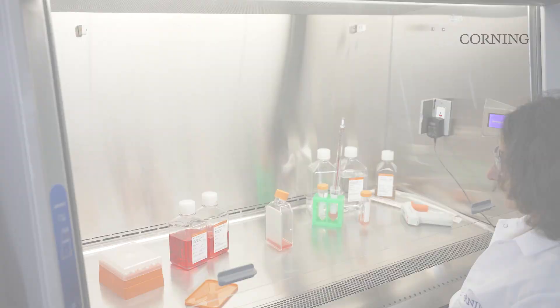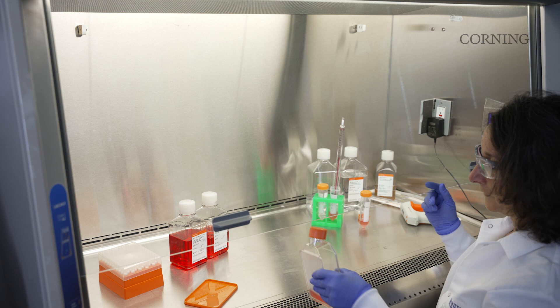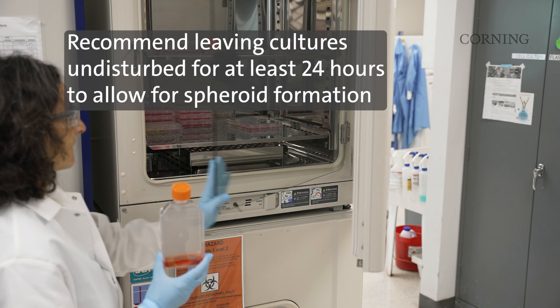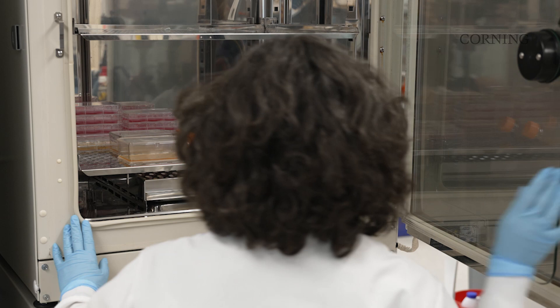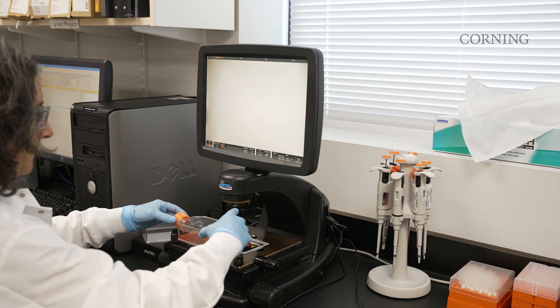Keeping the flask in the upright position, transfer it to an appropriate cell culture incubator. As you place the flask in the incubator, gently bring it to the incubation position. Allow the liquid to fully distribute across the micro cavity surface and swirl the flask lightly to evenly distribute the cell suspension. During normal handling, keep the flask in the incubation position and avoid tapping or hitting the edges of the vessel, as this may cause the spheroids to dislodge from the micro cavities.